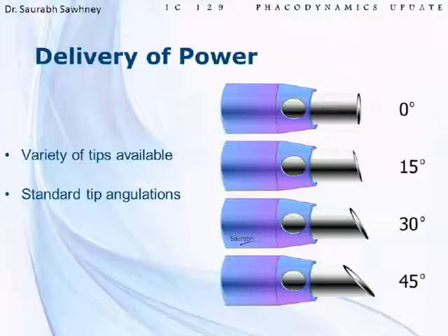It was earlier believed that the steeper the angle, the sharper the bevel, the more cutting you would get. This concept has now taken somewhat of a backstage, and in general we are quite happy with 15 or 30 degrees, which provide an efficient mix between cutting and holding properties of the tip.